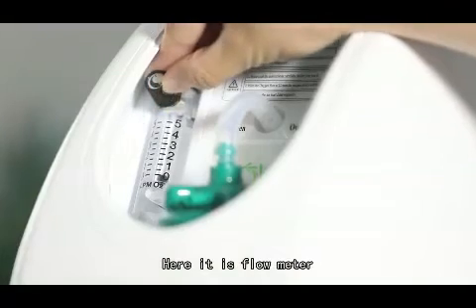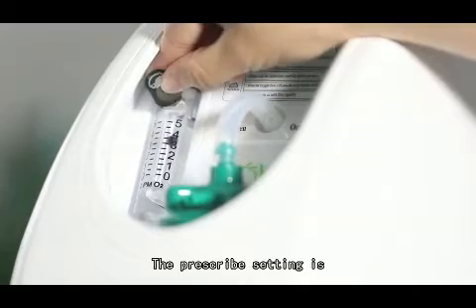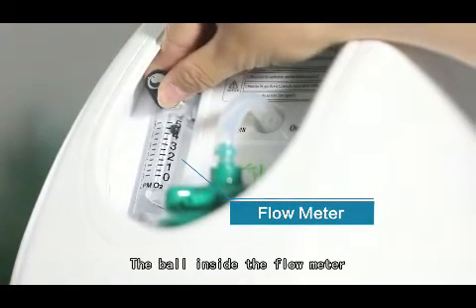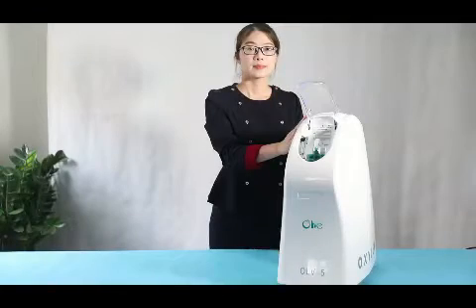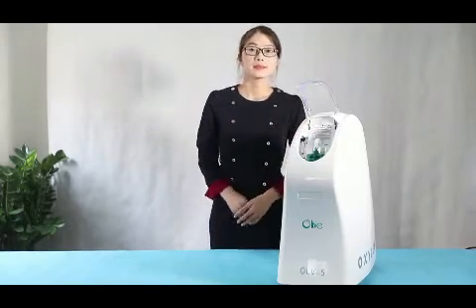Here is a flow meter, which is used to adjust the permitted flow. The prescribed setting is from 0.5 liter to 5 liters. The ball inside the flow meter will indicate the flow rate setting. Now, you know how to use the oxygen concentrator.